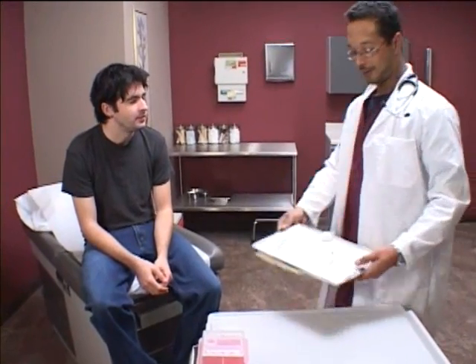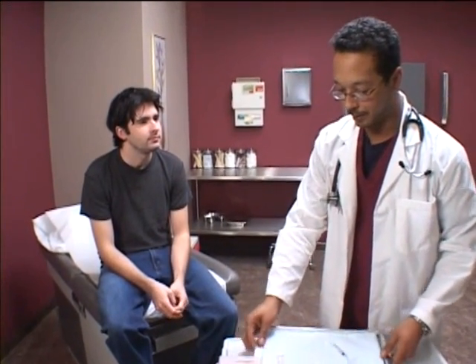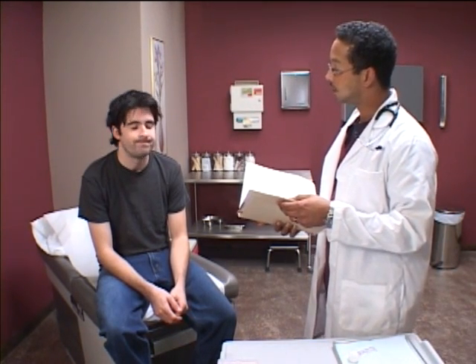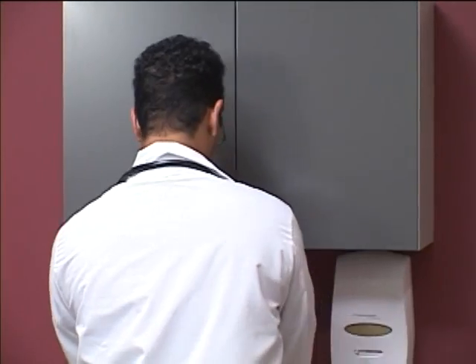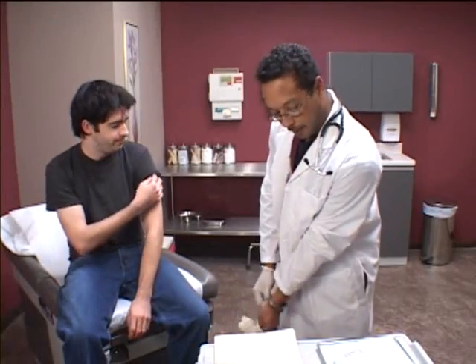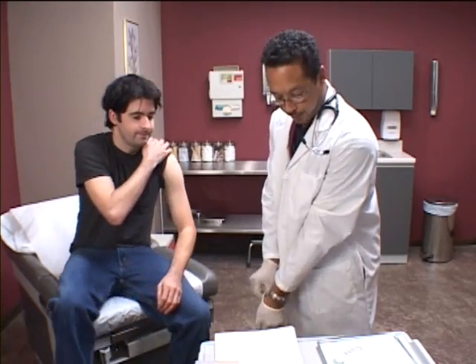Enter the exam room with a prepared syringe and greet the patient. Check the patient's chart for allergies, then explain the procedure and purpose of the medication. Wash your hands and put on clean gloves. Ask the patient to relax the arm, leg, or abdomen.